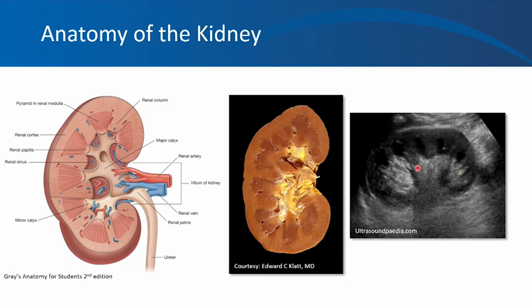And as I said before, fat is the brightest or hyperechoic structure you see on the kidney ultrasound. And the collecting system here is hypoechoic and pretty much similar to the cortex in echogenicity. And remember, the collecting system is not black unless there is urine backflow, that is hydronephrosis. You cannot usually see ureters unless they are dilated with urine.